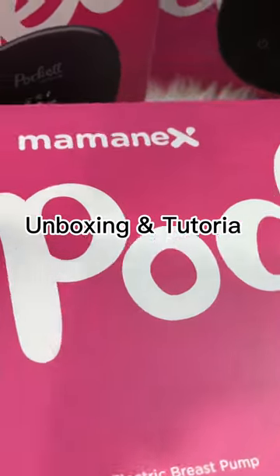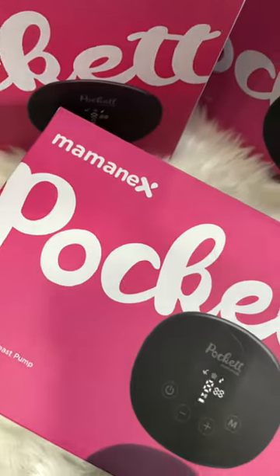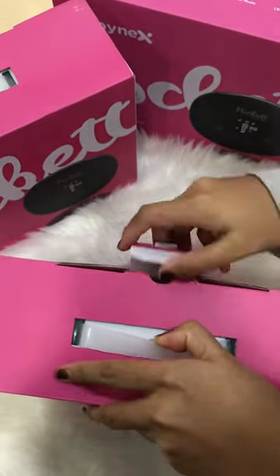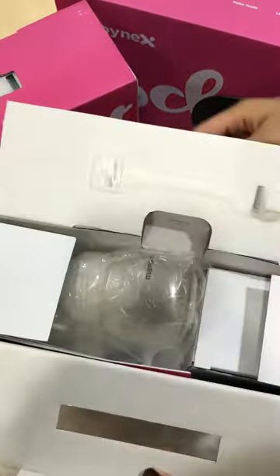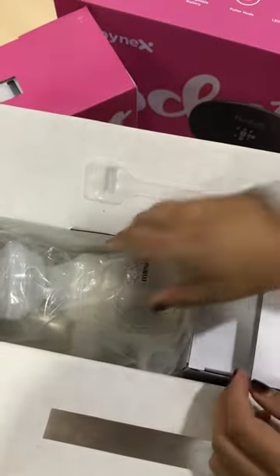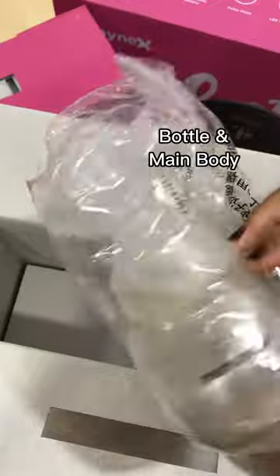Unboxing and tutorial for the Mominex Pocket. Inside the box you will find the user manual, the bottle, and the main body.